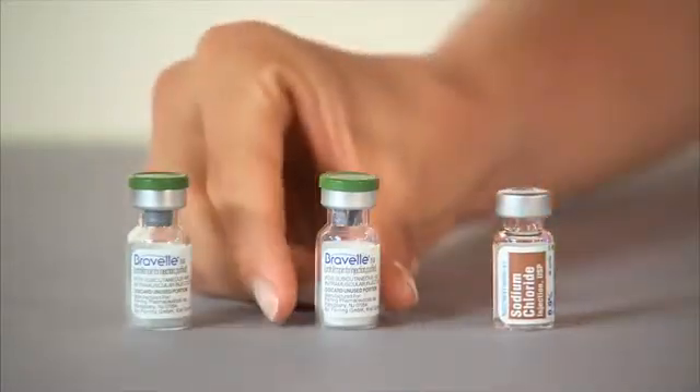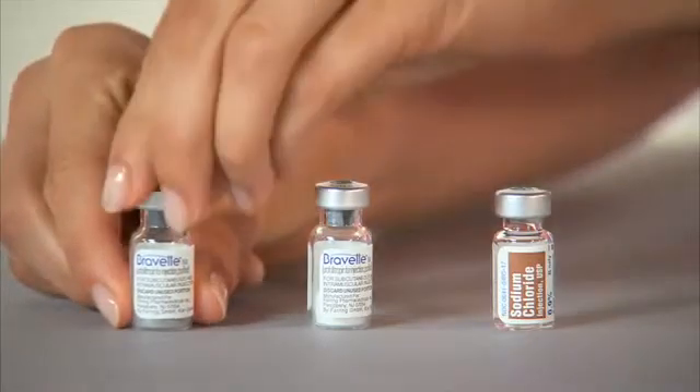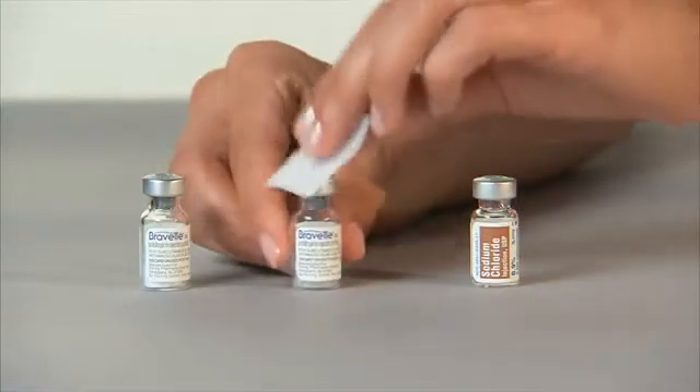Flip the caps off one vial of sodium chloride and each vial of Bravelle that your doctor has directed you to take. Wipe the tops with an alcohol swab.